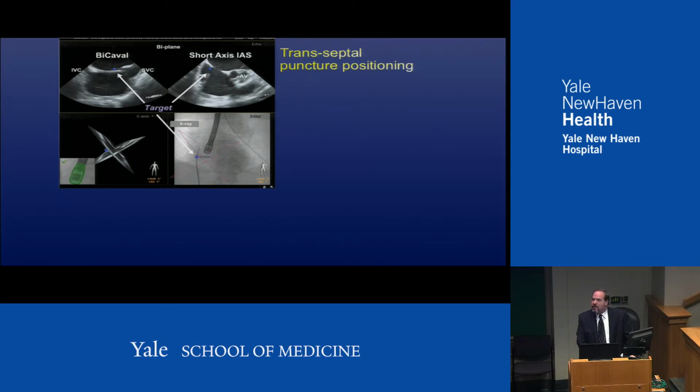The ostium secundum, interestingly, is not the bottom of the atrium. Everybody thinks that if we get too far down the ostium secundum, or the fossa ovalis, we're basically going to be in the bottom of the atrium. That's not true. You may be low in the fossa, but you're not necessarily low in the atrium. So in fact, for doing mitral clips and things, you want to be as far down so you can get posterior. If you think about the atrium, it's like a sphere, right?